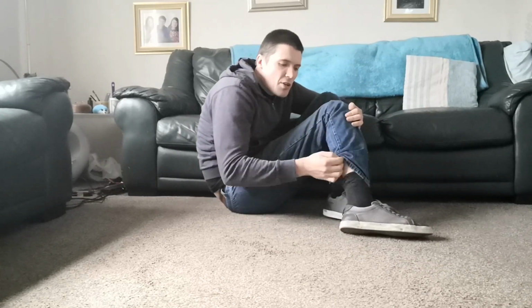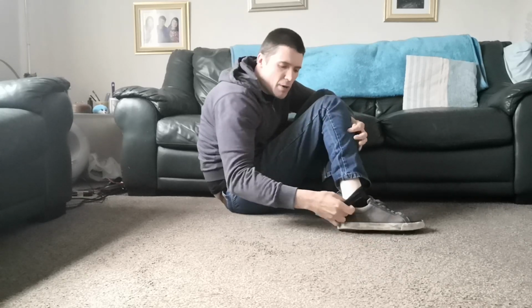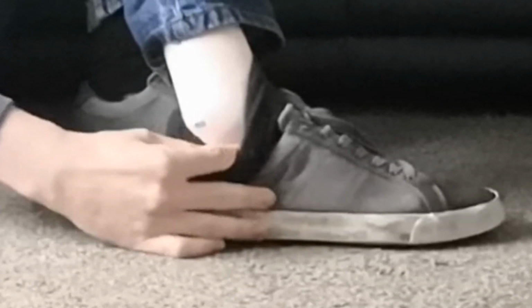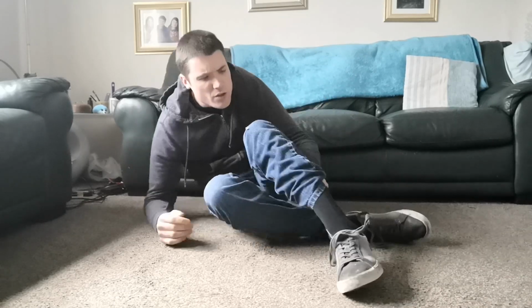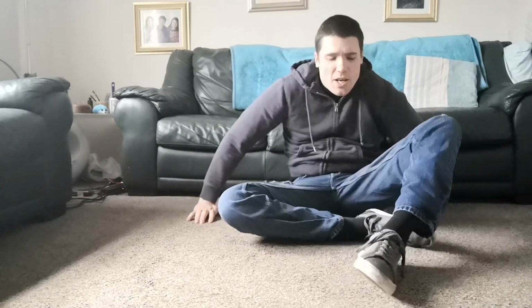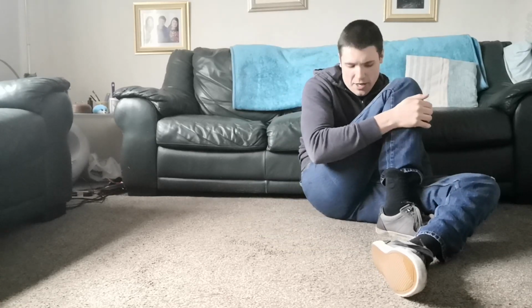So just get into position. I did do this quite a bit ago. Just drag my feet across the floor. If you don't have your shoes, you can damage your ankles like this. I had to dress this for a couple of weeks. So, important safety tip, make sure you're wearing your shoes, and make sure your ankles aren't dragging across the floor.